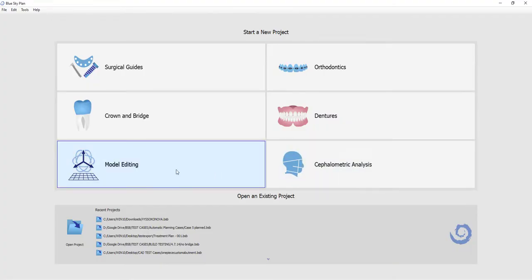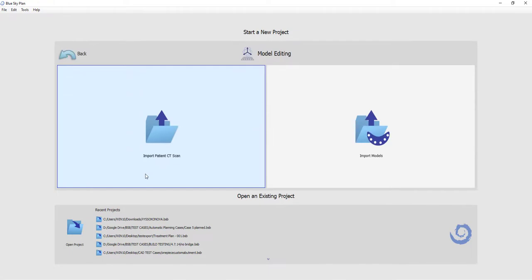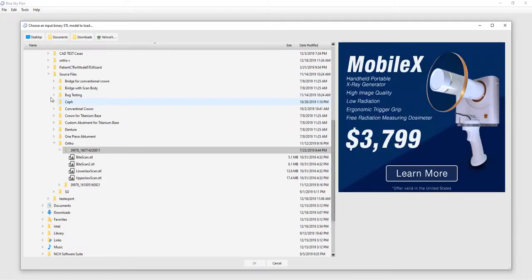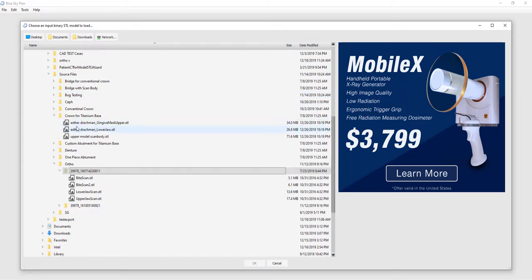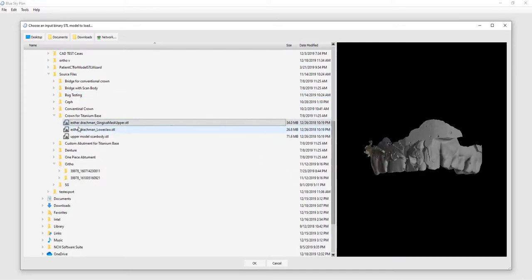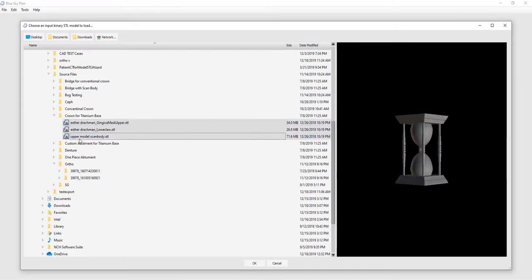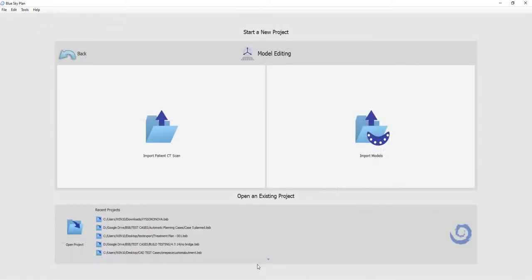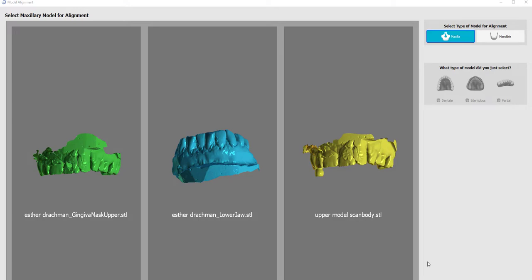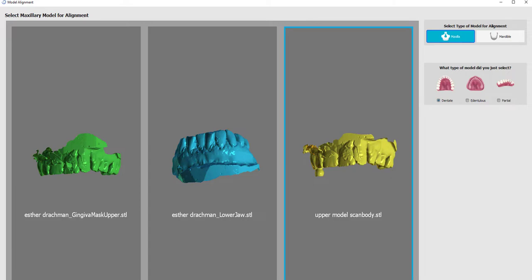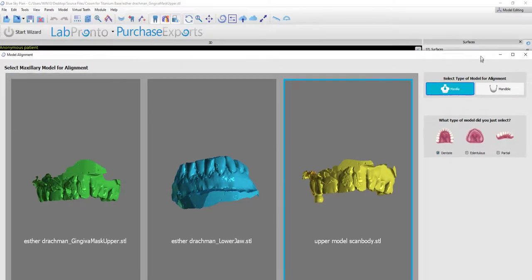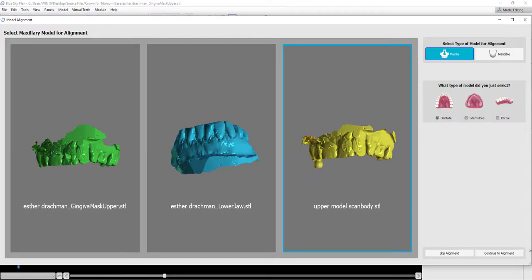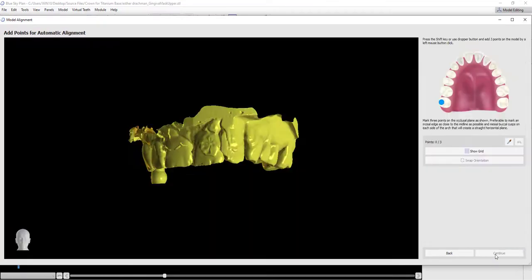And lastly, the process flow for importing a dentate arch. Here we are going to hold down the Shift key and select three different models. And the software displays for us images of all three with their file names. We are going to select one of them, the relevant draw type, and then continue to alignment.